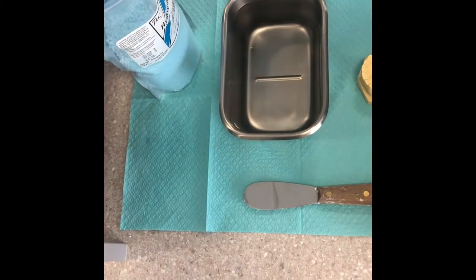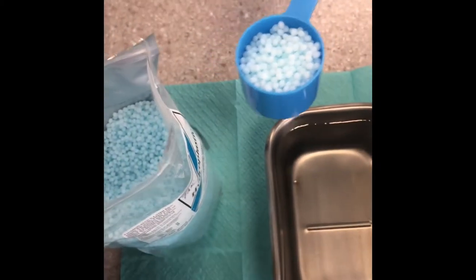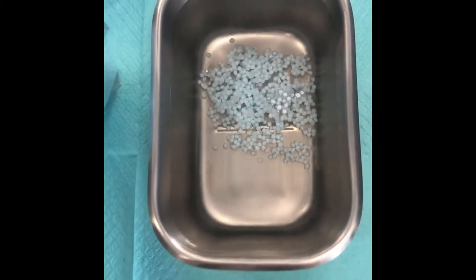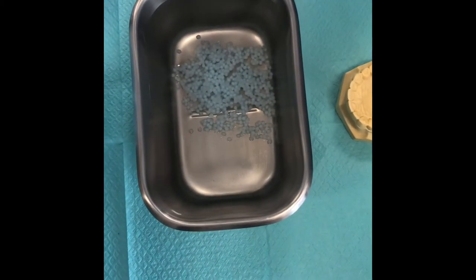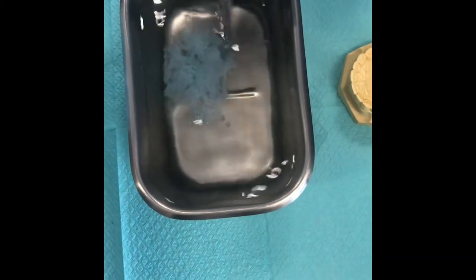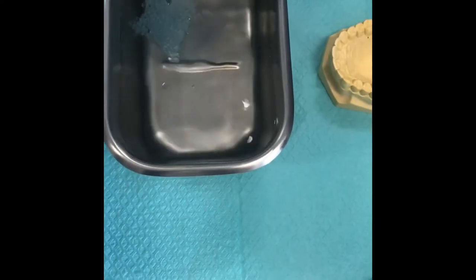We have hydroplastic little pellets. We're going to take one scoop and place them right into the hot water bath — that takes about a minute or so. The light blue pellets will start to turn clear, and they begin sticking and clumping together as they heat up.